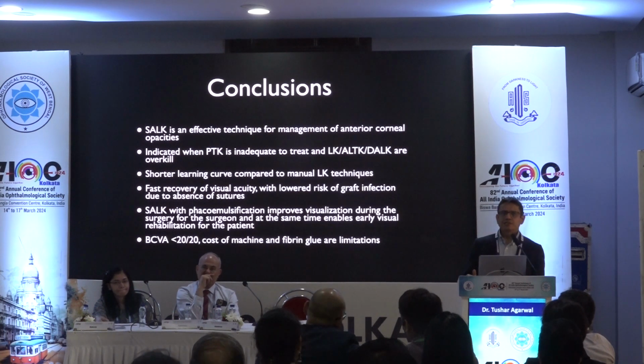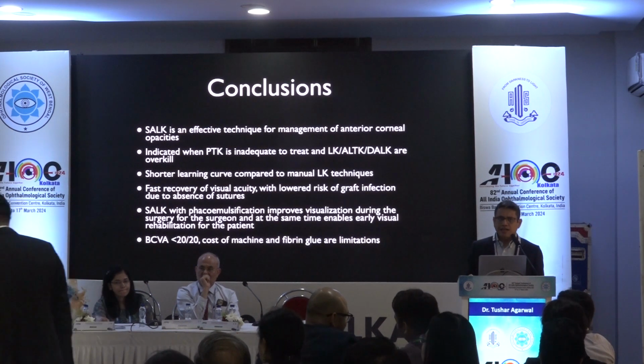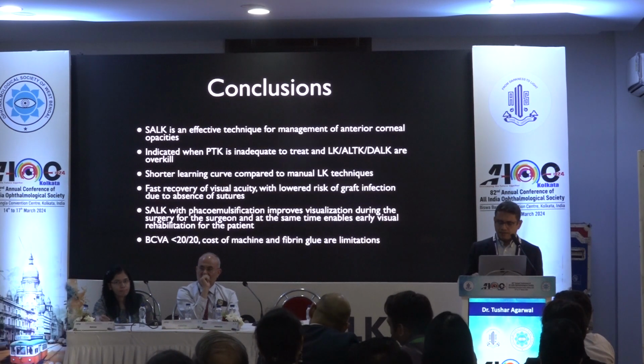A couple of limitations: the best corrected visual acuity generally stops at around 6/12. Then there is an added cost of the keratome machine and the fibrin glue.